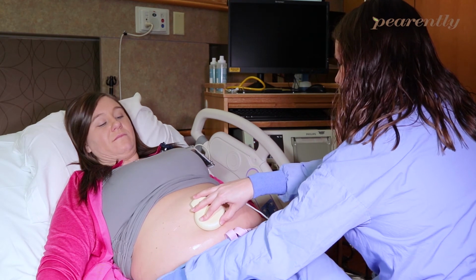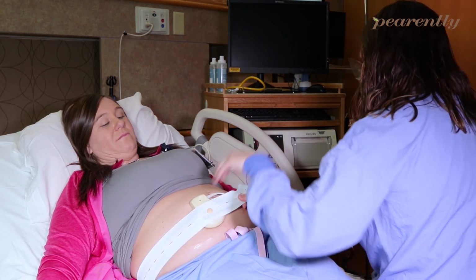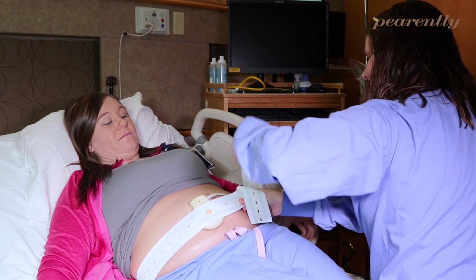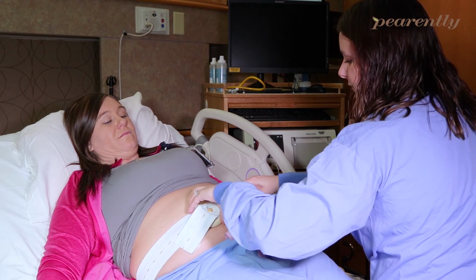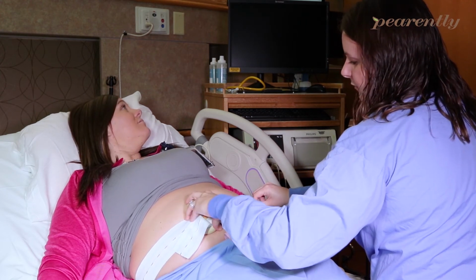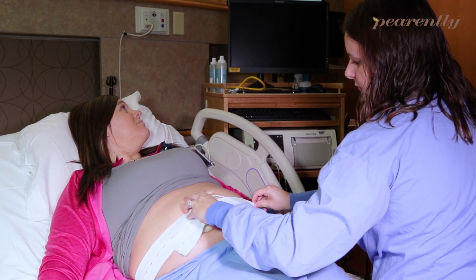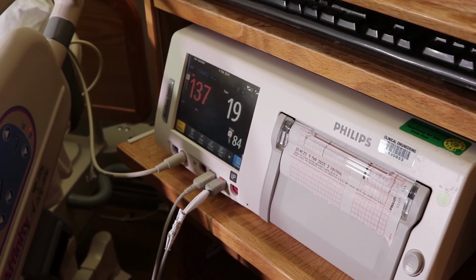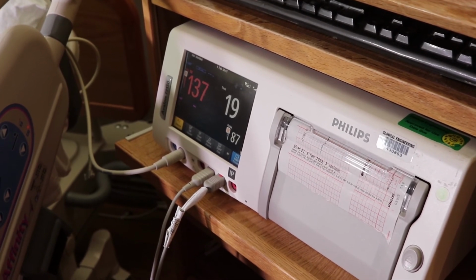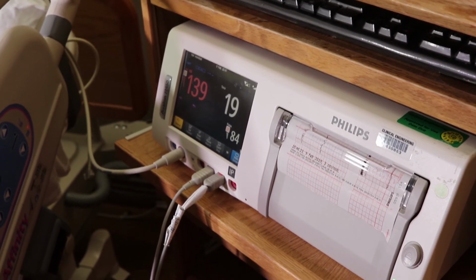Today we're doing a non-stress test on a woman that is 27 weeks pregnant. The registered nurse that's putting her monitor on, the first monitor is evaluation of the fetal heart rate. As I've stressed in prior videos, the normal heart rate of a baby that's in utero should be between 120 and 160 beats per minute. So you can hear the baby's heart beating, and it's in that range.